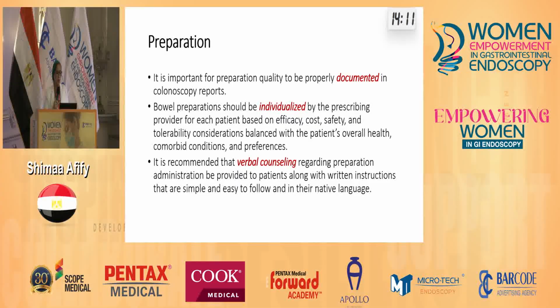Bowel preparation should also be individualized for each patient by the prescribing provider based on the efficacy, the cost, the safety, the tolerability of various solutions, and also the comorbid conditions of the patients. As we said also, it should be with verbal counseling, and you should take your time and spend it with the patient to make it proper.